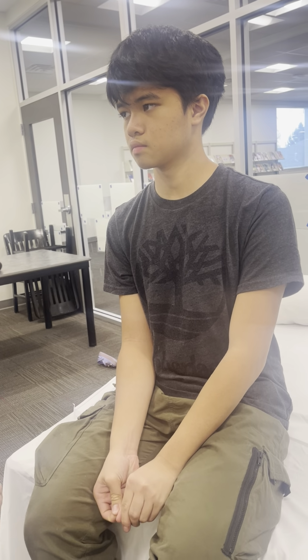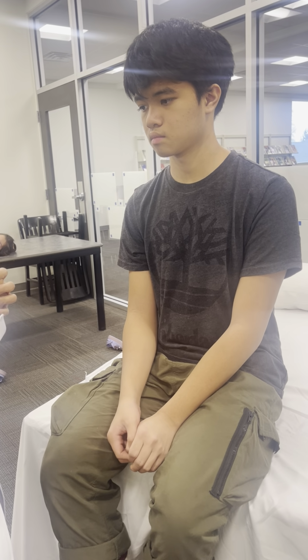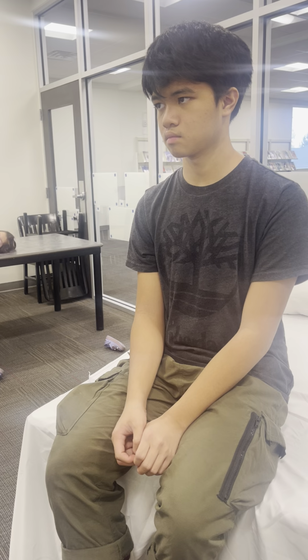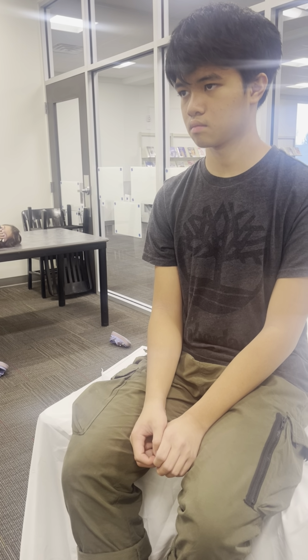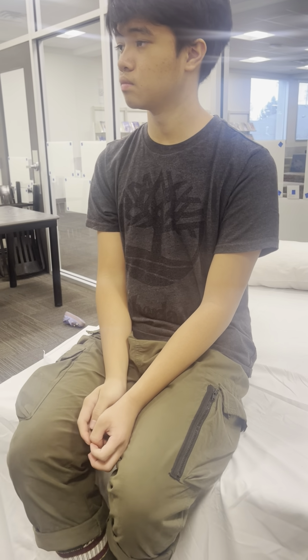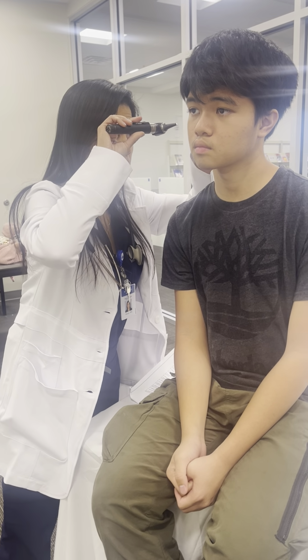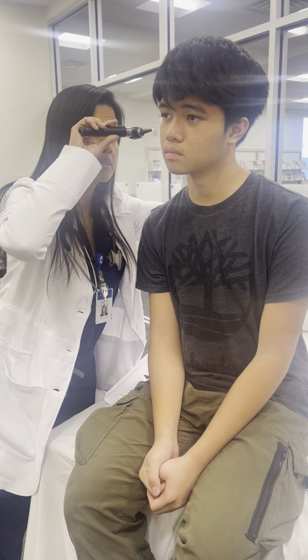Okay, so next we're going to do a visualization of your ear canal and tympanic membranes. Okay, so let me get my otoscope. So I will start with an inspection. So I'm going to place the otoscope in your ears, looking at the external canals for any discharges, drainage, signs of infection, or if you have any inflammation inside your ear. Okay.